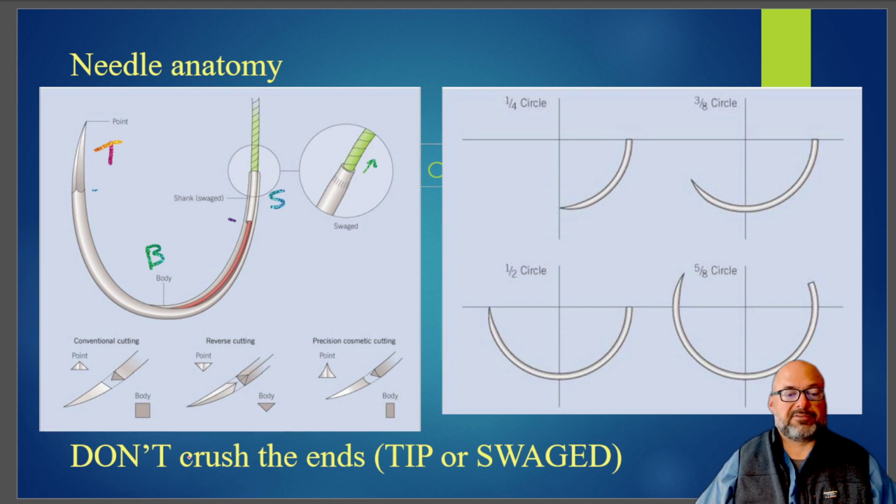One of the things that I always tell medical students and residents down here at the bottom, do not crush the ends of the needle. If you really clamp down here at the swedged end, you can turn it into a pop-off. It can dislodge the suture when you don't intend to.